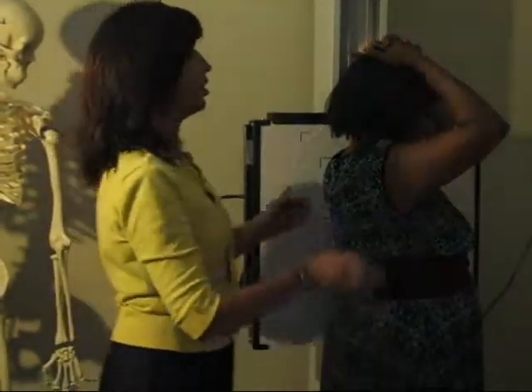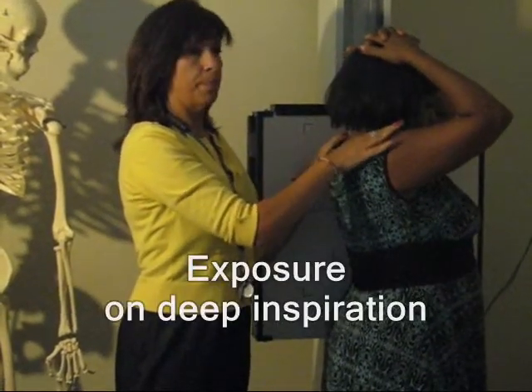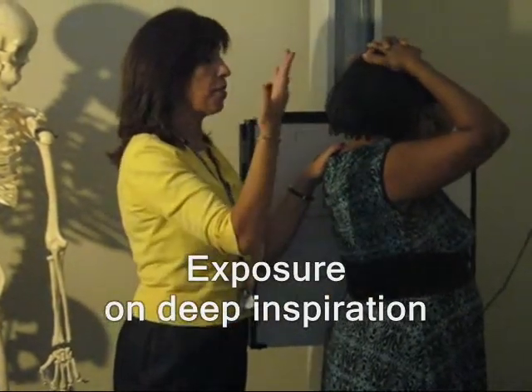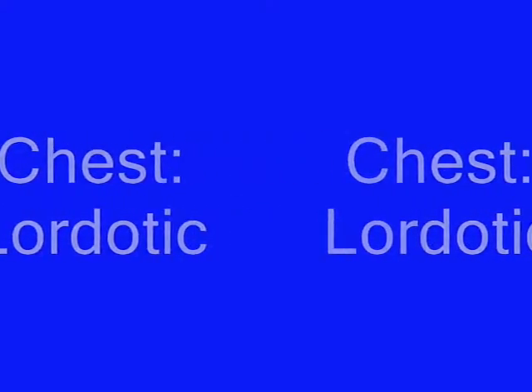You would have the patient take a deep breath in, take a big breath out, empty completely, take a big breath in, and you would shoot the picture.